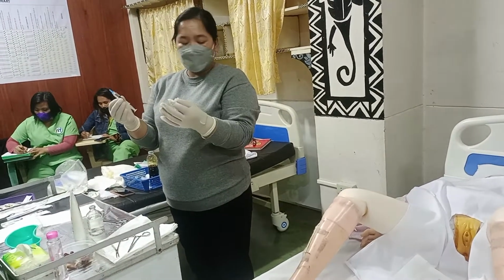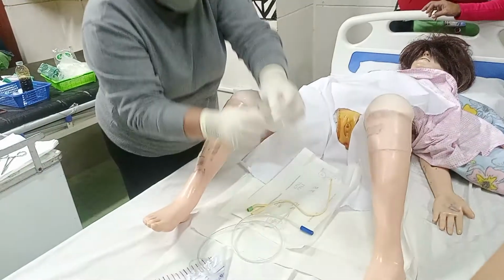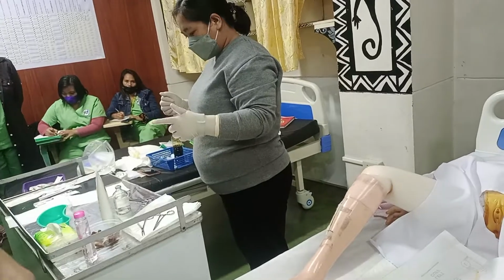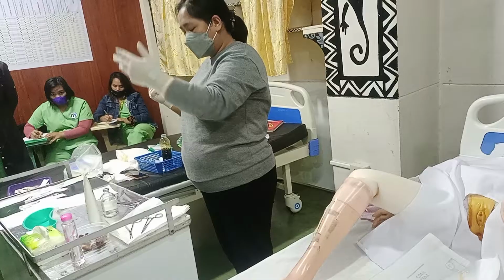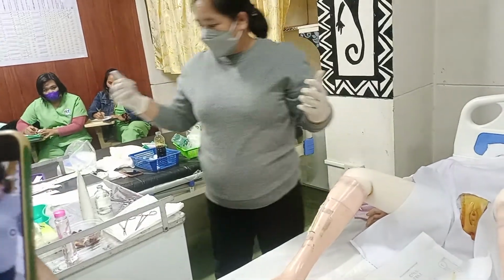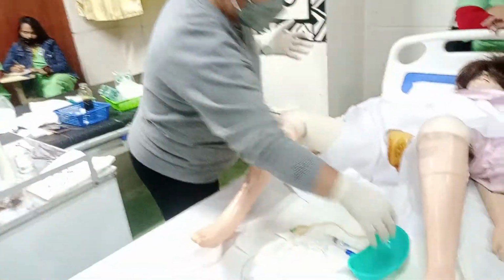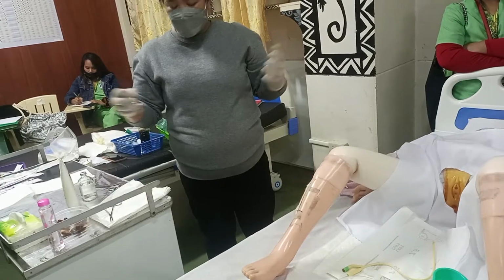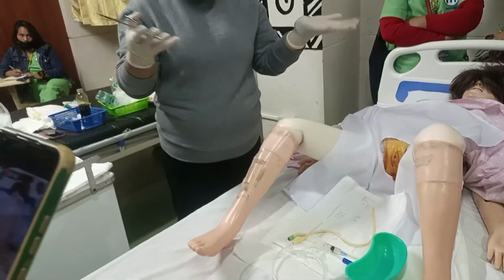Kapag nagtutusok kayo, you can leave it there and then do the fishing. Okay? And then, okay na. Mag-prepare ka na lang dito ng pagtitake natin mamaya ma'am. Tatlong short lang. Okay? Then, I will get my kidney basin. Usually, naka-cover yan para malinis siya. And then, I will get my forceps. Okay?